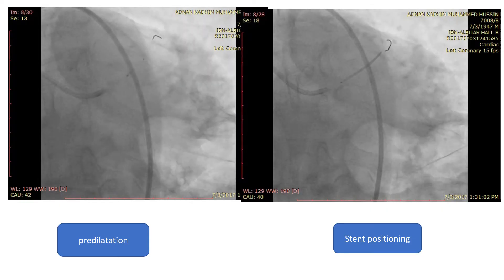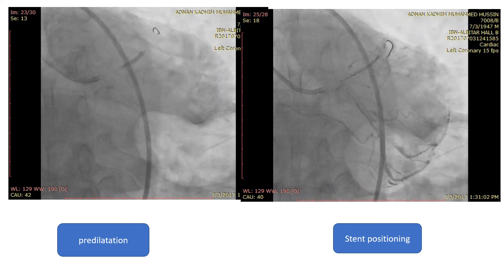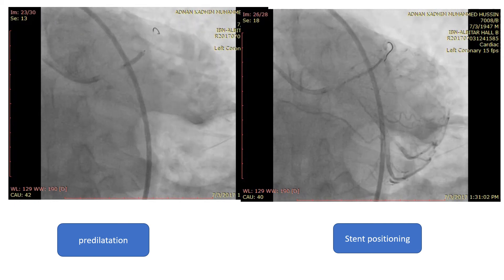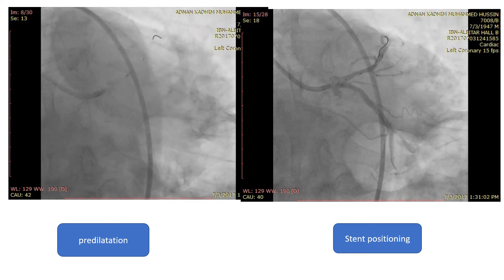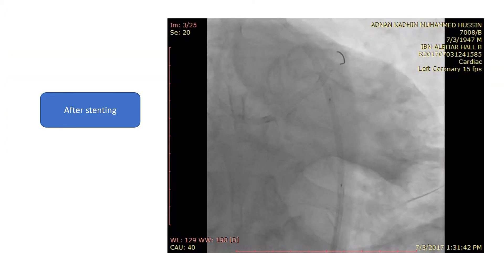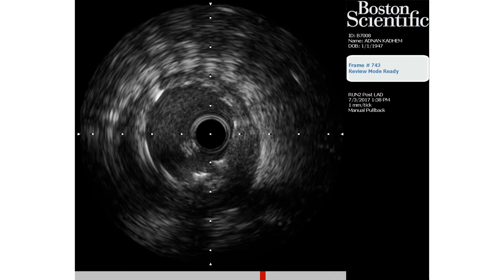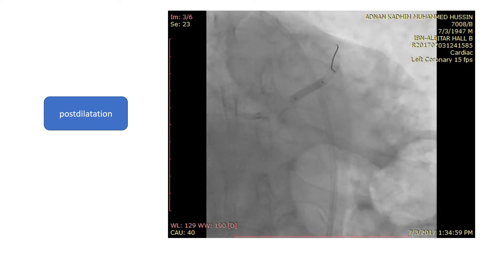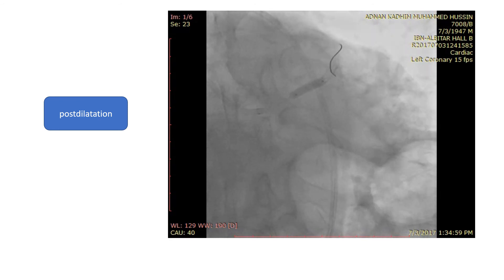So the lesion was pre-dilated. Here we can see positioning of a stent that is 3.5 by 34 millimeters. This is the result after stenting — it looks pretty good. But IVUS showed that there is some stent under-expansion; although it is apposed, it is under-expanded. So it was post-dilated with a non-compliant balloon of 3.5.